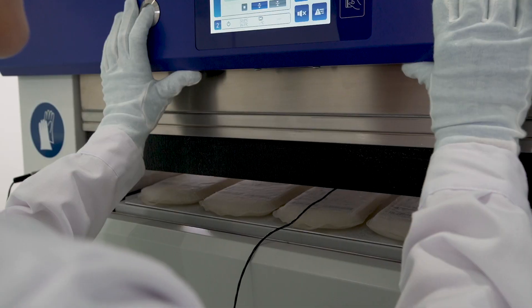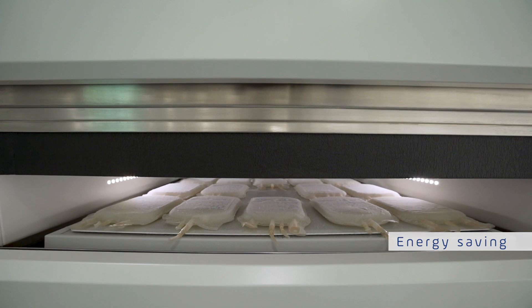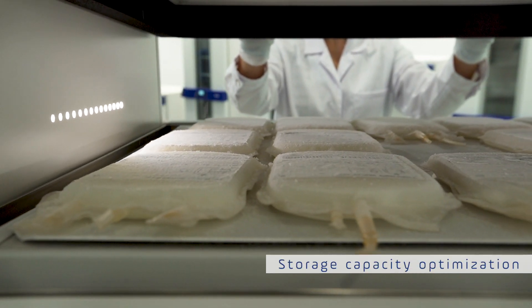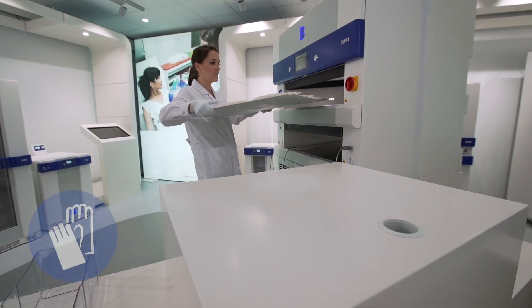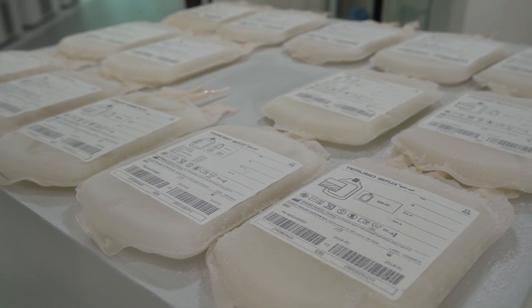Proceed with the unloading at any time. The Eco Mode will ensure that your freshly frozen plasma is kept at the right temperature. Your bags are now evenly frozen and super flat. The accurate temperature control has avoided all freezing waste and wastage of plasma.